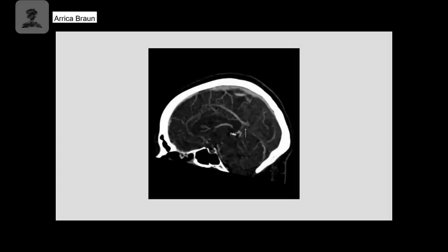Okay, so that is what we would see for a venogram. So we are going to watch, and some of your sinuses that we're particularly looking for are going to be back here. We want to be able to watch as the contrast moves. So these are all arteries still. But once they get into the brain, they're perfused. Then we're going to wait until it gets back into the sinuses. You should see more of a collection of the contrast rather than it being kind of this awkward, weird shape. And typically, that's due to a thrombus of some sort blocking some of that flow.